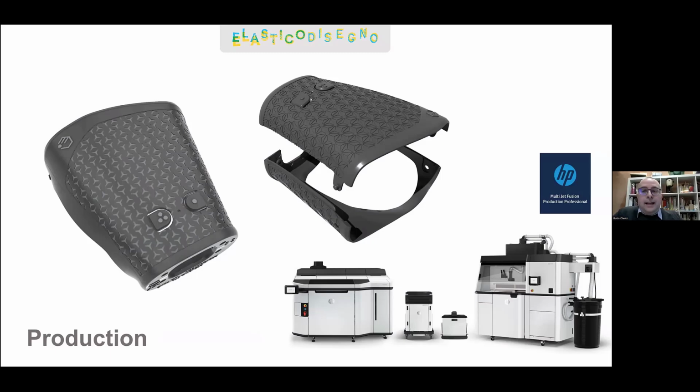Even though all parts were designed to be injection molded, the production volumes for a device like this are, luckily on one hand, too low to justify such investments. And so we identified the Jet Fusion technology by HP as a perfect match for producing these parts. They use PA12, a very strong and durable plastic, which was used for the frame and for the covers. The glove is cast in silicone, and we used the HP printer to 3D print the molds for casting the silicone parts. This is the silicone glove.